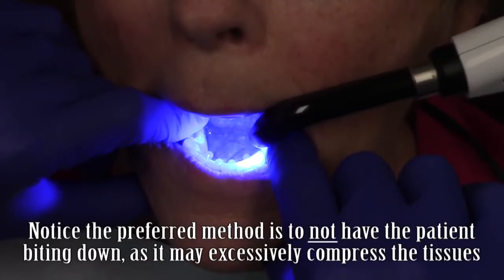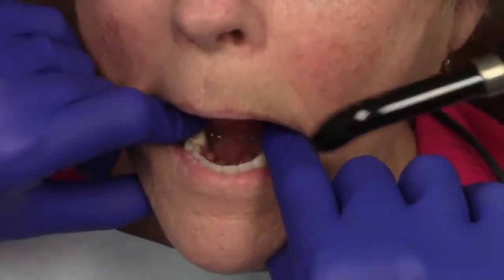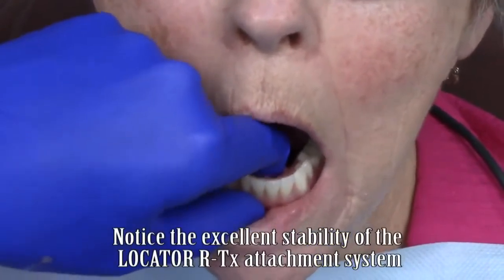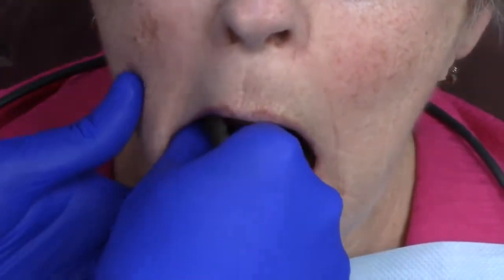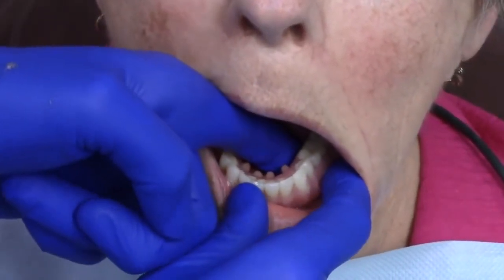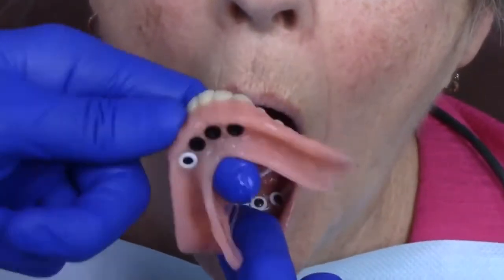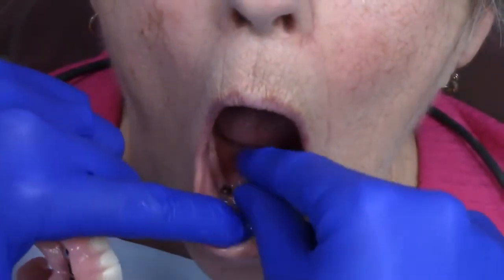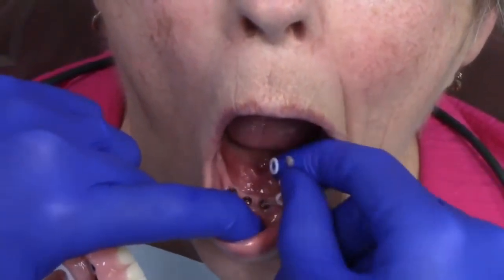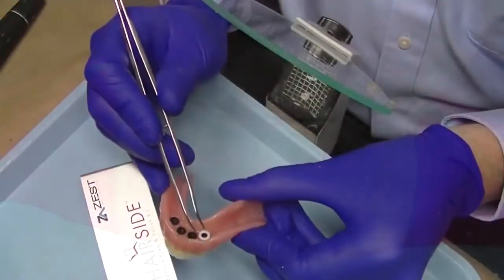I use a light curing unit to cure the chair side attachment processing material. After approximately two minutes, complete polymerization of the attachment processing material is achieved. Notice how firm the denture is to the edentulous ridge and the implants. I instruct the patient that they might feel a lot of pressure during removal. Notice how I carefully remove the denture, ensuring I'm visualizing any loose material, such as block out spacers, inside the mouth or on the Locator RTX abutments.